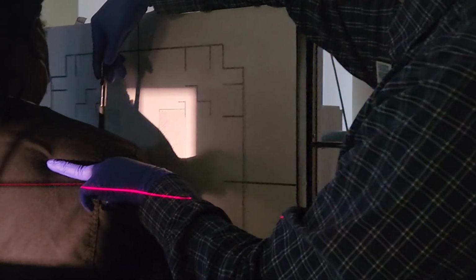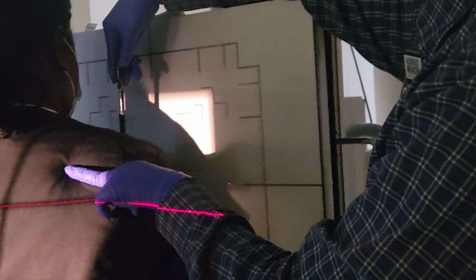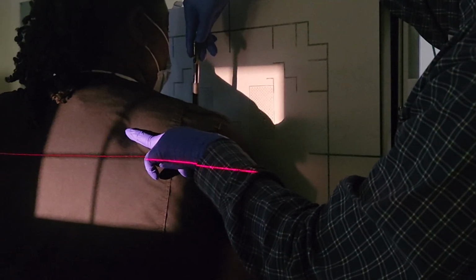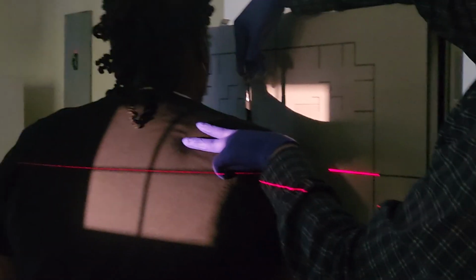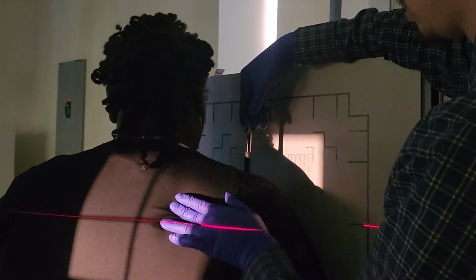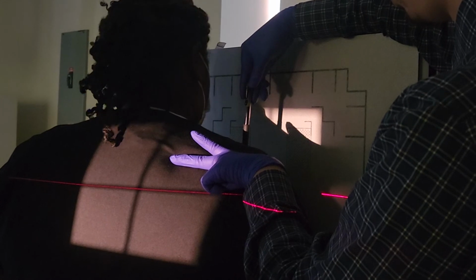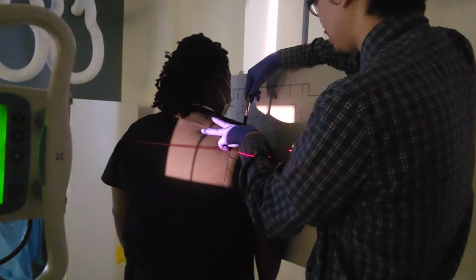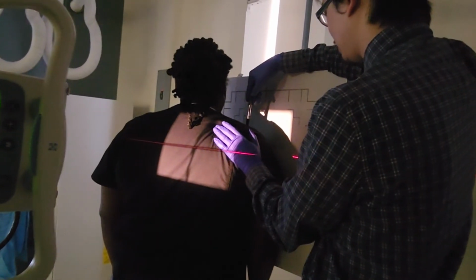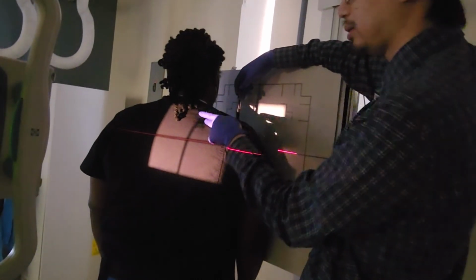So Shamika, what we're gonna have you do is turn your left shoulder slightly closer to the IR. Nope, other way. Turn towards the IR. Yep, keep going. A little bit more. Stop there. Turn a little bit more. Okay, good, stop there. So superior angle, AC joint. Okay, slide to your left. Okay, bring your left shoulder back just a tiny bit, away from the IR. There you go. Right there. So, superior angle, AC joint.